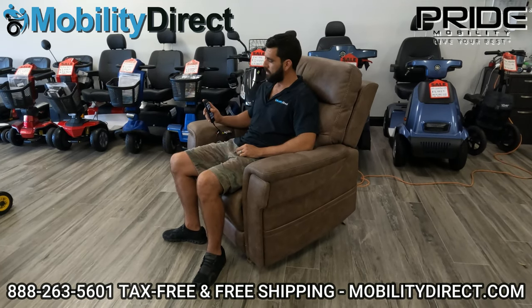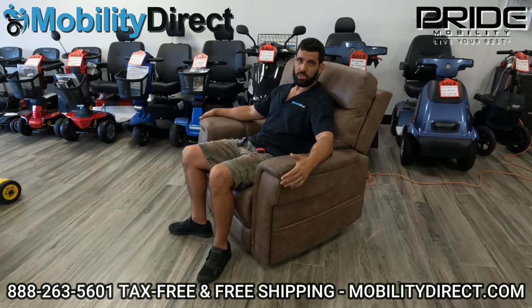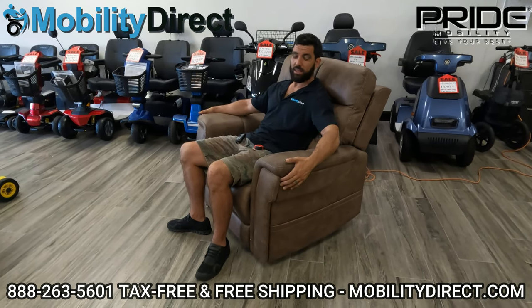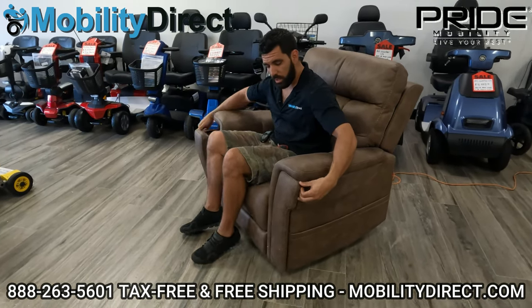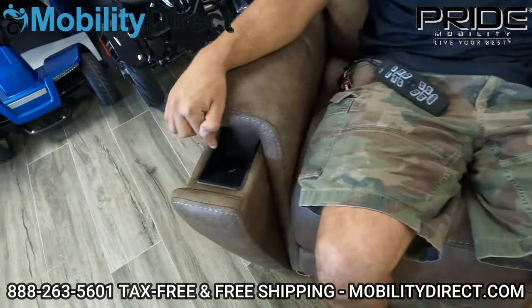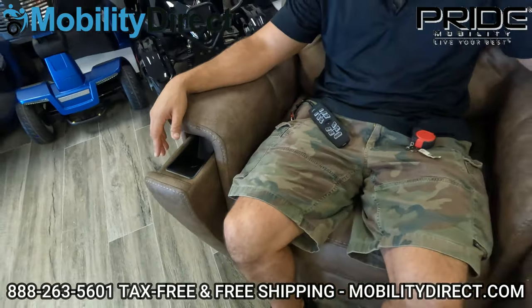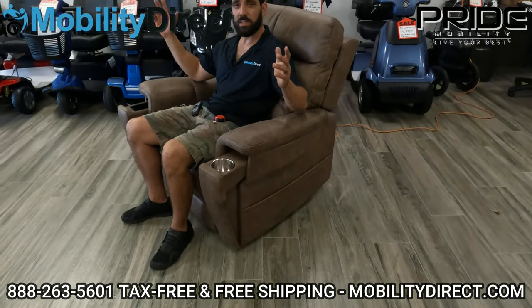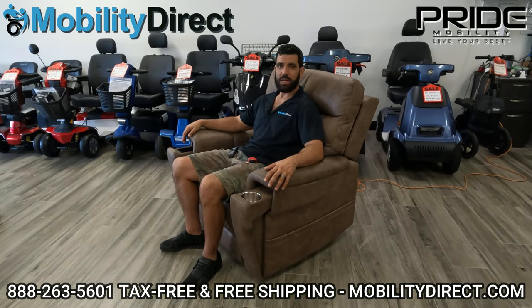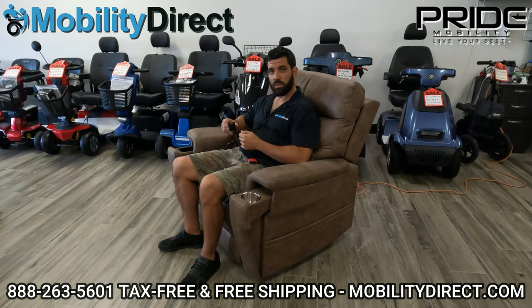I'm going to show you one other neat feature this chair offers. Only one other model made by Pride offers this feature — it's called the Atlas lift chair. The Atlas is very comfortable too, but this is the newest model. With the Atlas and the Radiance, you have retractable armrest features. On one side you've got a cup holder, and on the other side you've got a wireless charging station for your phone. All you have to do is drop your phone on that and it's going to wirelessly charge your phone, as long as your phone is capable. Pride Mobility is keeping up with technology innovation. If your phone doesn't have that feature, you've got the USB charging port on the front of the remote that you can plug your charger right into.